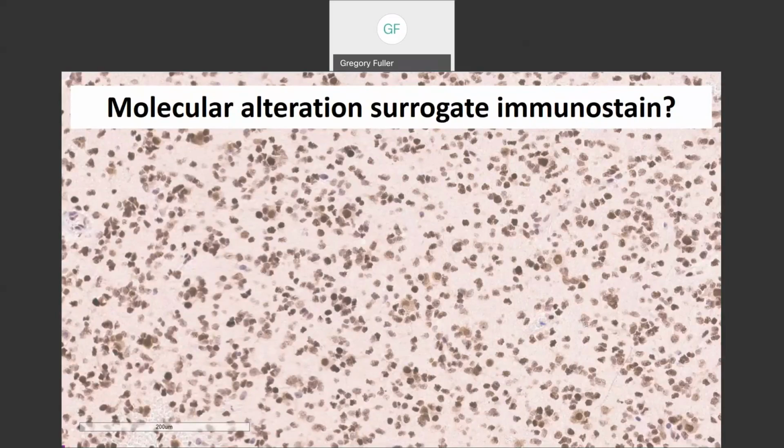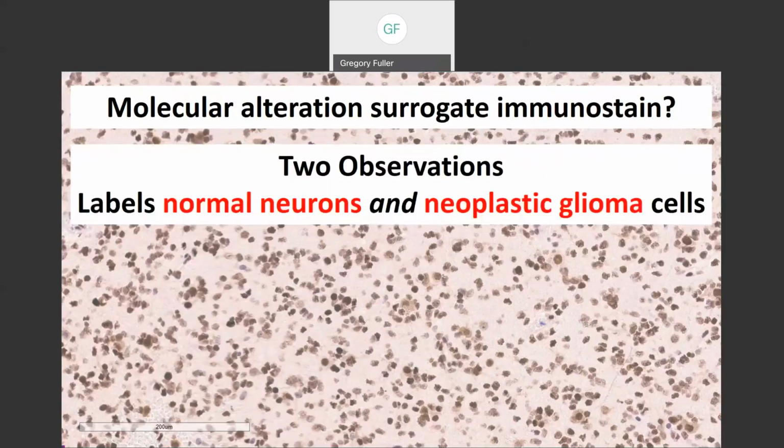One key, okay, let's make the observations for all of you. I know we have a lot of probably neuroradiologists listening that can't quite get there. Dr. Gilbert is correct, the neurons are the answer. Dr. Cathcart says the same thing, and Sergio says the same thing. Let's walk through it, shall we? All right, here we go. This is the reasoning process.